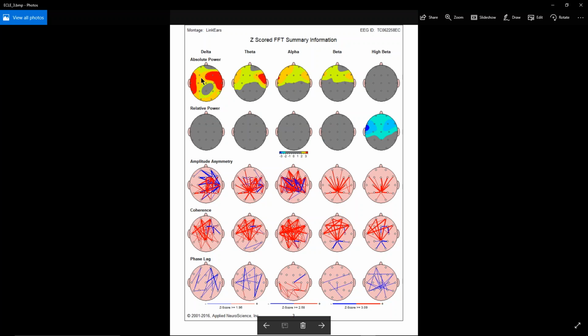So if we understand a little bit about neurophysiology from looking at some of our resources, we can say that, okay, this person has issues with memory and executive function and vertigo, balance, vestibular system issues. Where are those located? And we can go from there and say, okay, these areas should be targeted.